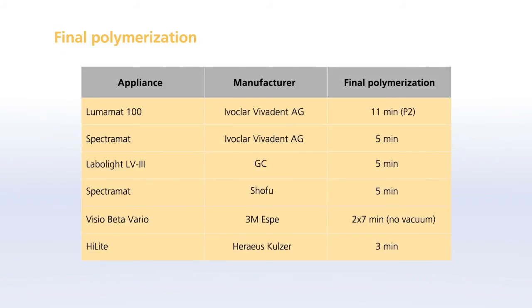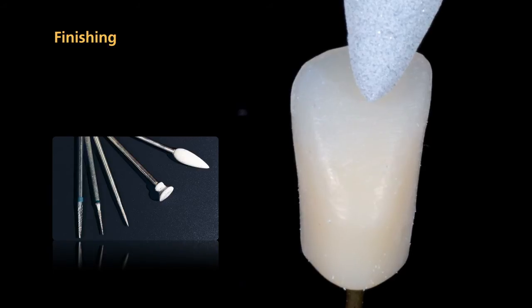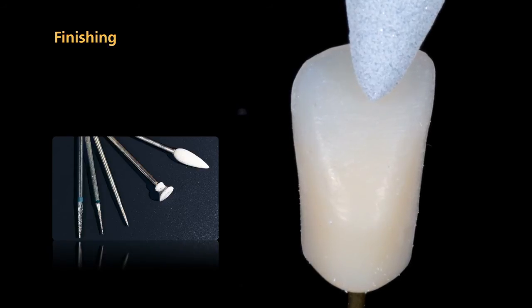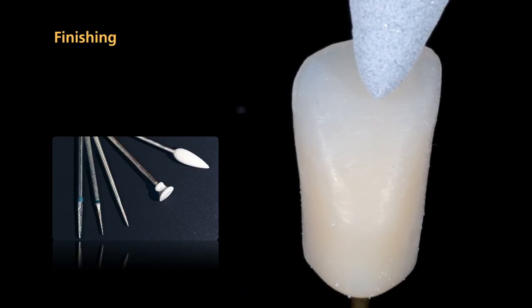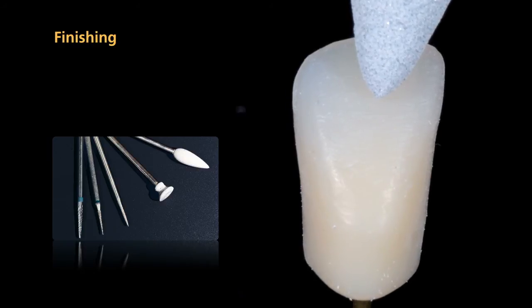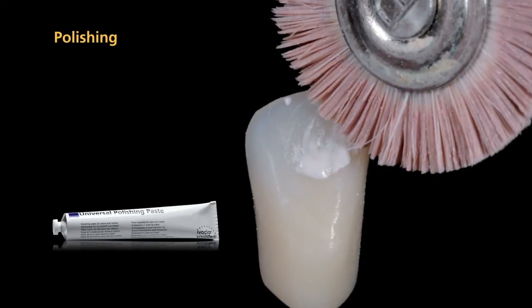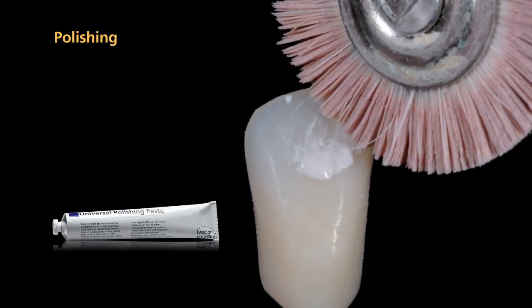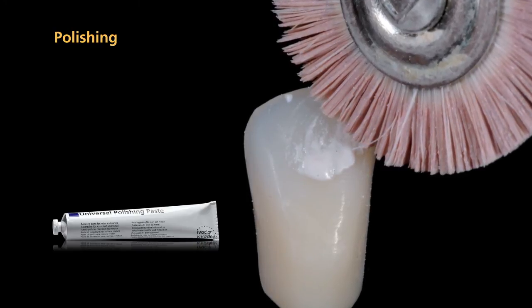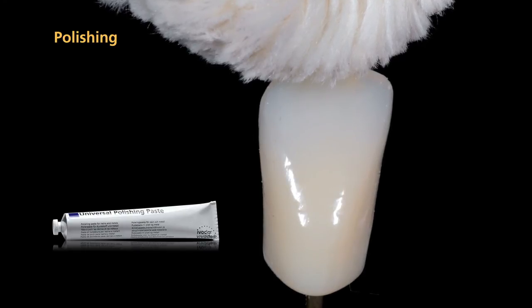Final polymerization is carried out in the Lumamont using PROGRAM-2. Use cross-cut tungsten carbide burrs and fine diamonds for the finishing steps. You may use customary polishers such as rubber polishers and silicone wheels to finish the surfaces. After finishing, polish the surfaces with universal polishing paste and a goat hair brush. Use a cotton or leather buff to achieve a natural high-gloss finish.